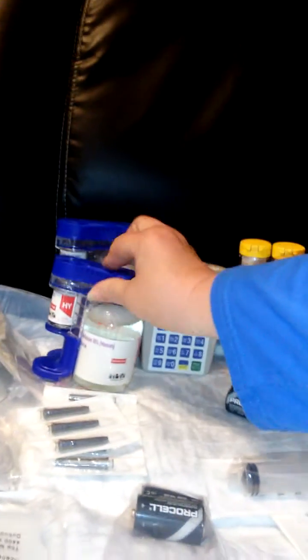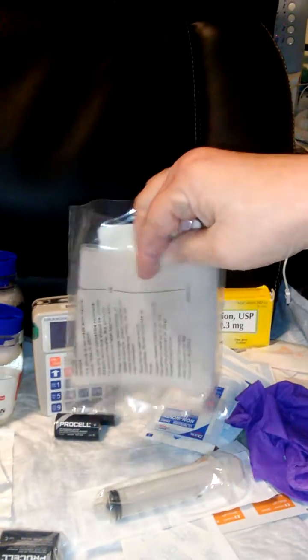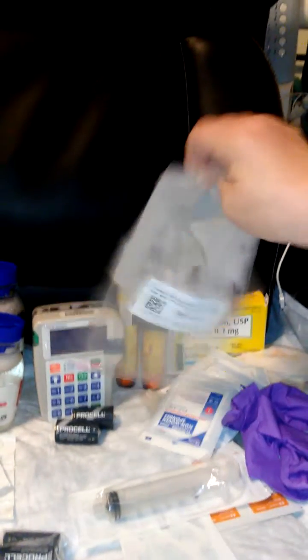So behind here is my pump that works my IV. I got my IV pole right here. This will hold my pump, and I am doing this in my yarnery because this is where I spend the majority of my time. But these are the batteries that go in this pump. I've already washed my hands, in case anyone is questioning. That is very important, that your hands are clean.